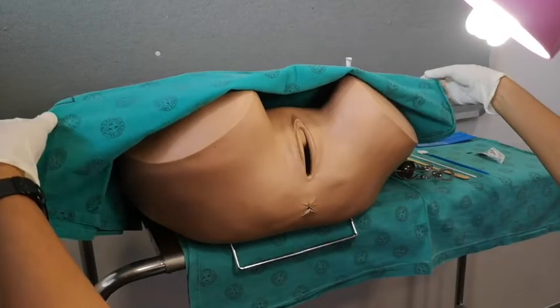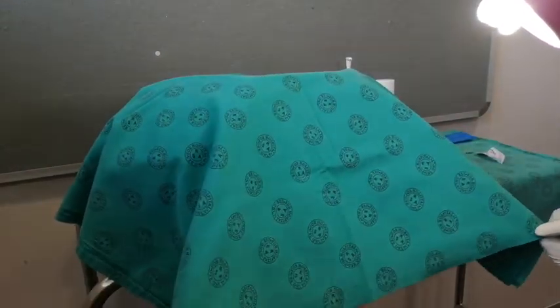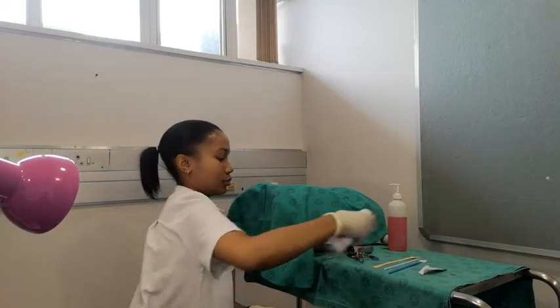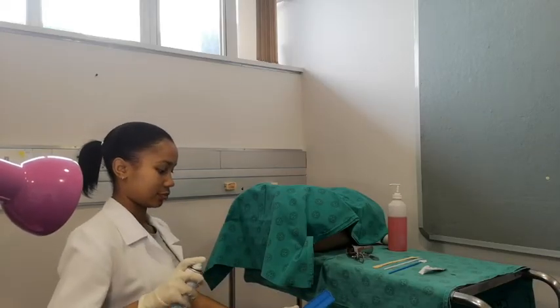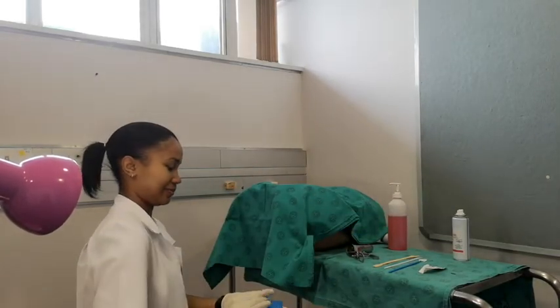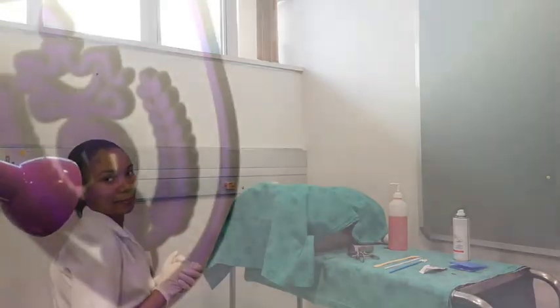Having completed your examination, cover your patient, thank them, and give them some privacy and disposable towels to clean themselves while you fix the slides. Hold the fixator spray at least 30 centimeters away and spray. Remember to label your slides and allow them to dry before submitting them to the laboratory.